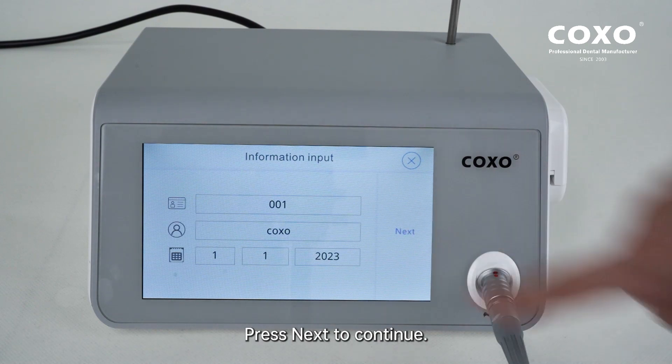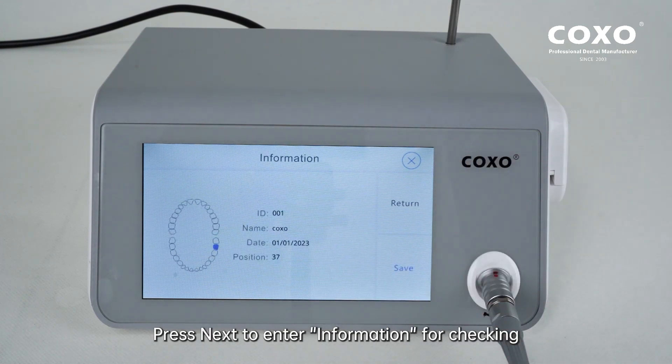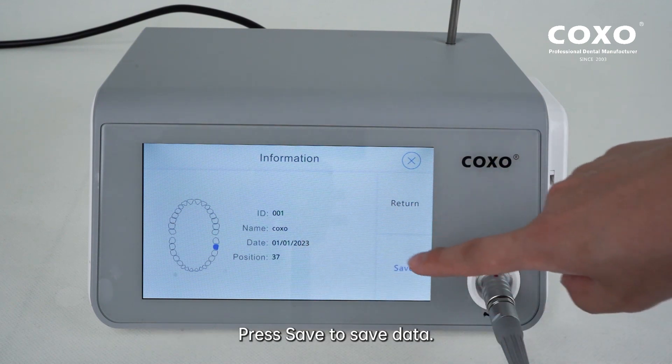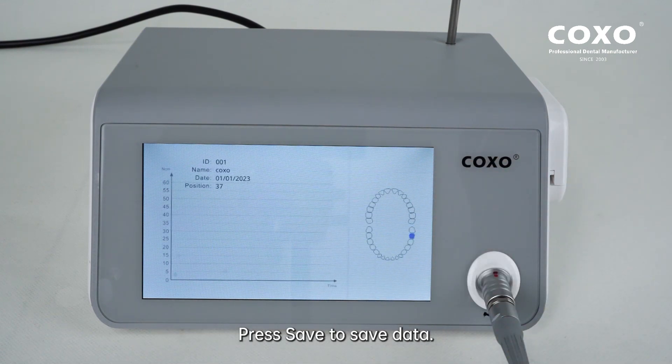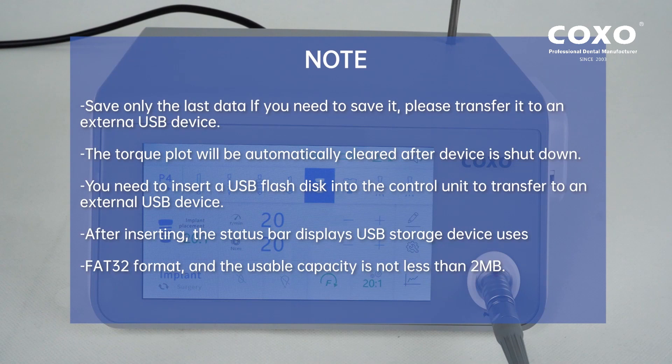Press Next to continue. Select the corresponding implant position. Press Next to enter information for checking. Note: save only the last data; if you need to save it, please transfer it to an external USB device. The torque plot will be automatically cleared after the device is shut down. You need to insert a USB flash disk into the control unit to transfer to an external USB device. After inserting, the status bar displays USB storage. The device uses FAT32 format and the usable capacity is not less than 2 MB.